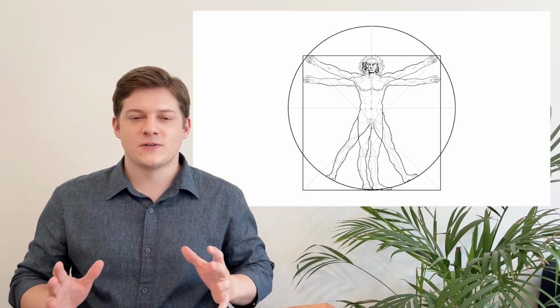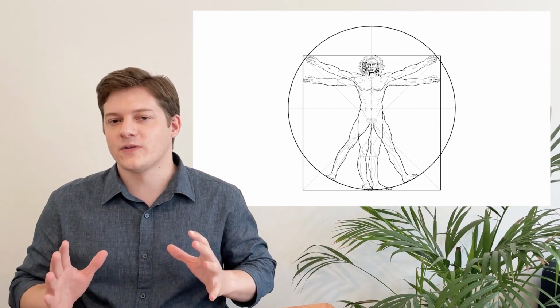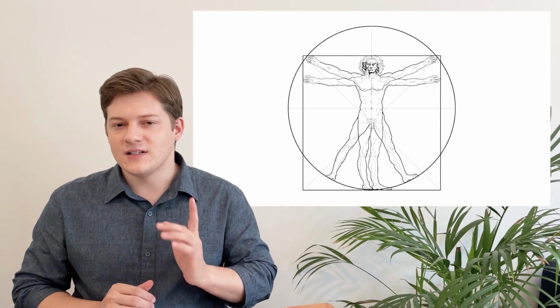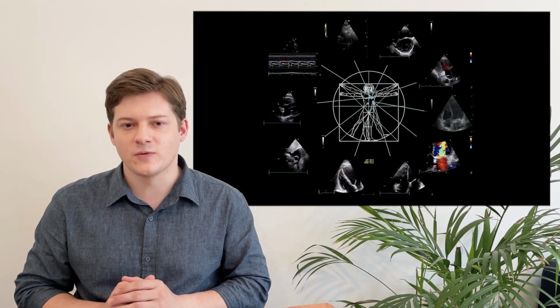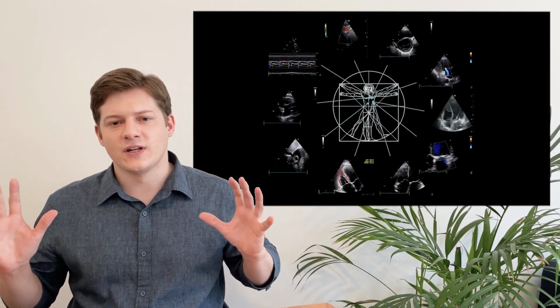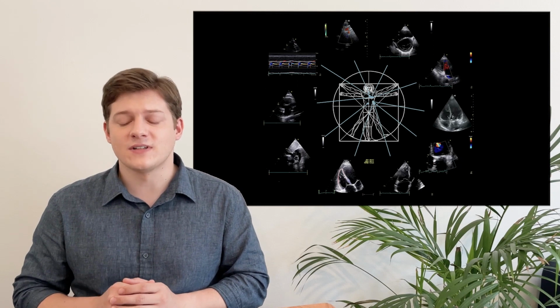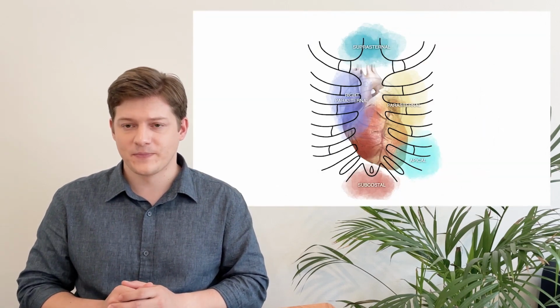In this lecture series, I will show you all the possible views you can acquire to scan the heart. The heart is truly a fascinating organ, and as you can see, there are plenty of views, plenty of modalities you can use to get information out of your loops. But how do you do that? How to even start your journey in echocardiography?